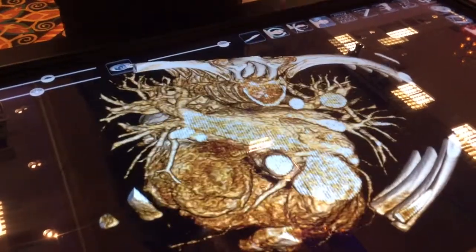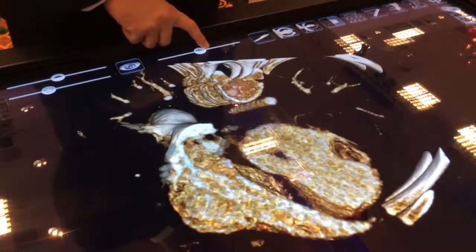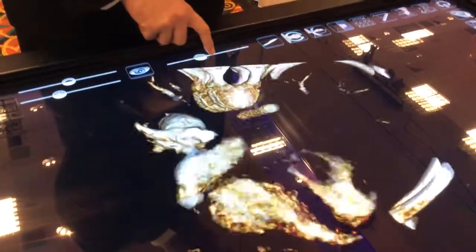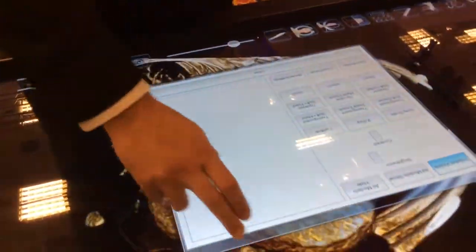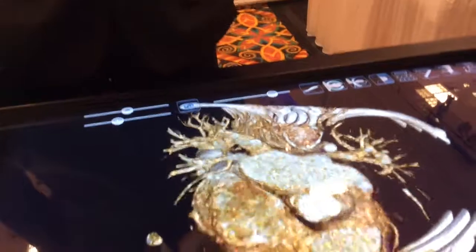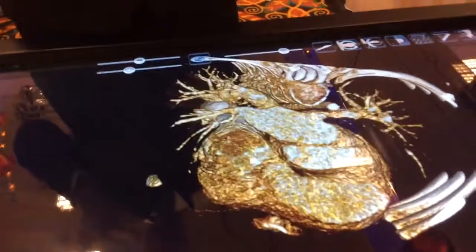And we can still cut into this data here. Yeah. And so you can go down, you can see the different compartments of the heart. You can show students how you can trace blood flow here. You can see vessels. So can you upload different models? Let's say if you had access to a file of someone who had a cardiomyopathy or a baby with a tetralogy of Fallot, or we actually have tetralogy of Fallot. You've got tetralogy in there. Wow. That's cool. You have transposition of the great vessels and all that other good stuff.